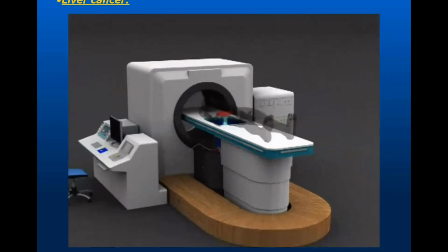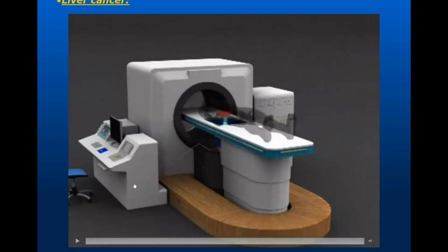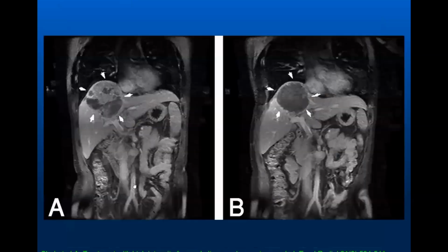We keep doing this, what we call sonications, like shots, so that we can cover the tumor over time. Everything is controlled from here, as you can imagine. This is a case that just shows you, this is of course one of the extreme cases. This is really a big tumor and in a very challenging location. Usually the tumors that are very close to the heart or the dome are very challenging, but as you can see here, again, before the ablation, you see all this enhancing tissue. After the ablation it becomes so black. So this is how it works.